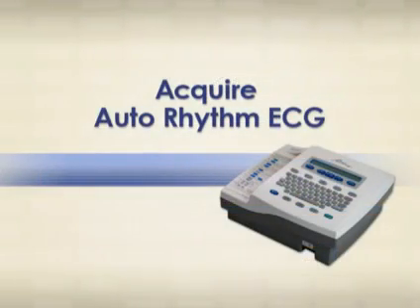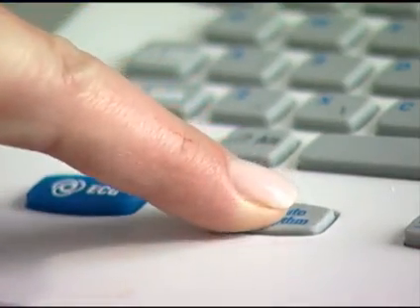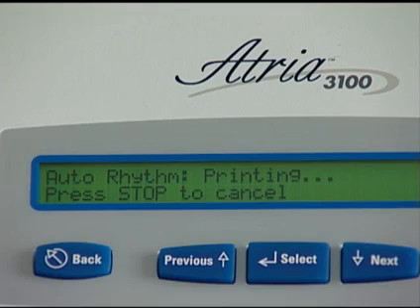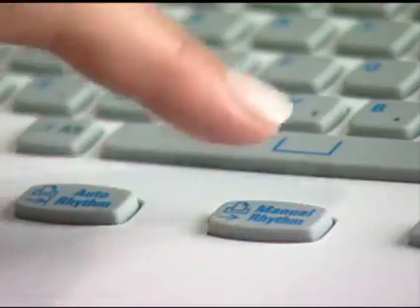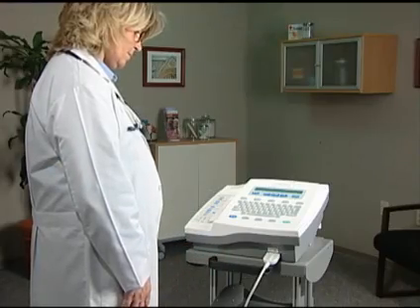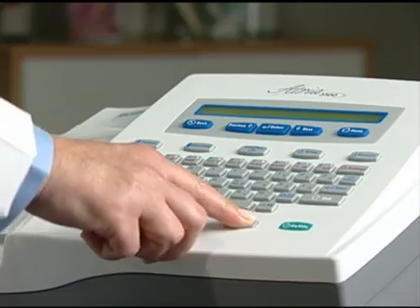To generate an automatic rhythm report, press the Auto Rhythm key. To change the number of pages the report prints, see the User Settings section of the manual. Or for a manual ECG, press the Manual Rhythm key. Press Stop to end the printout.